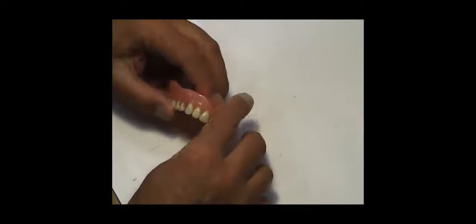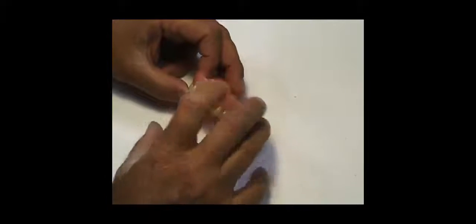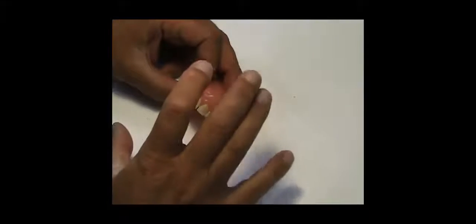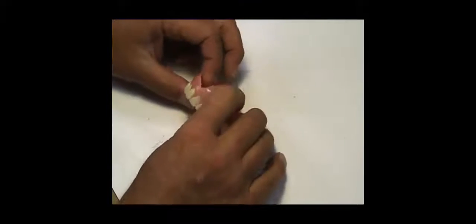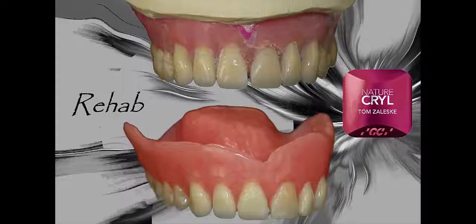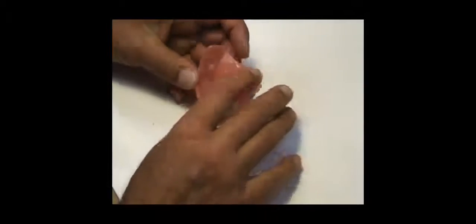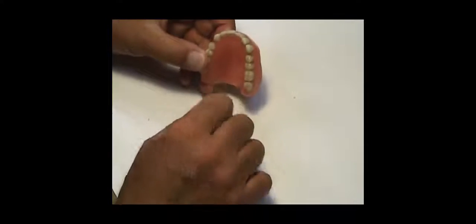The last thing I need to do is want to spread my creative wings and color characterize this and put contours in it that this originally didn't have. This patient more than most is very set on getting exactly what he had except just freshened up. That's exactly what I did - I freshened it up, removed all the gnarly stuff. Nothing's moved, nothing's changed except the acrylic base and a reline impression.